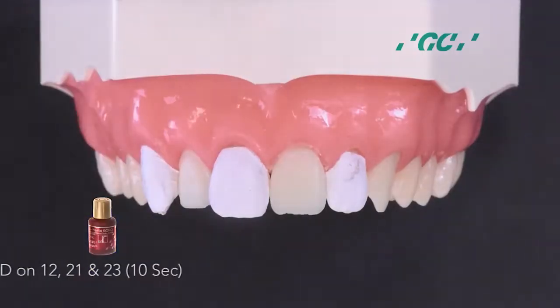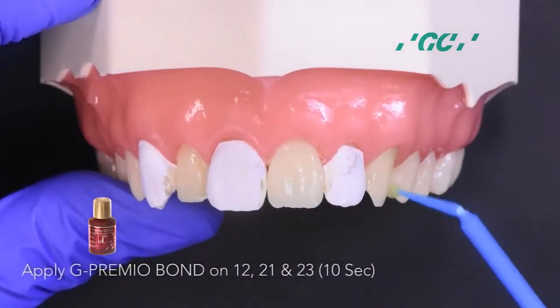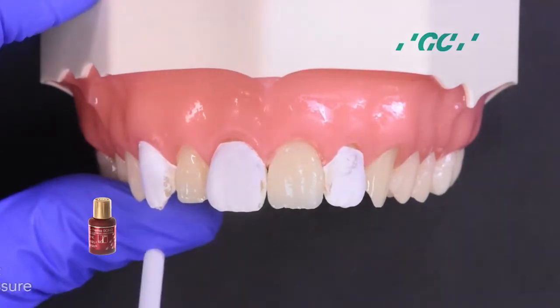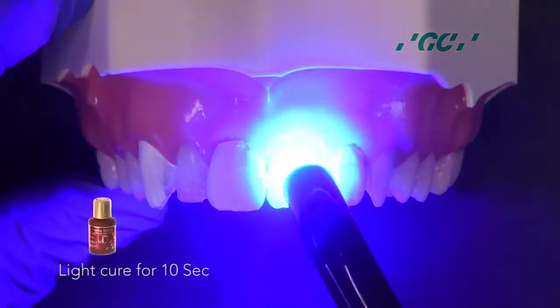Isolate 1-3, 1-1 and 2-2 with plumber's tape. Apply G-Premio Bond on the adjacent teeth. Dry with maximum air pressure for 5 seconds, then light cure for 10 seconds.